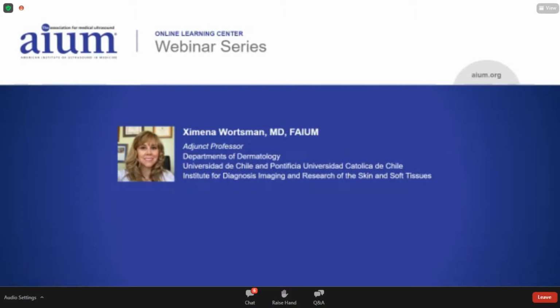I don't know if we have more. We have one more question in the Q&A. Okay, what kind of technique did you use to create the orange images? I don't understand the question. Can you clarify that? I don't know if the person could write something because I don't understand the orange images.